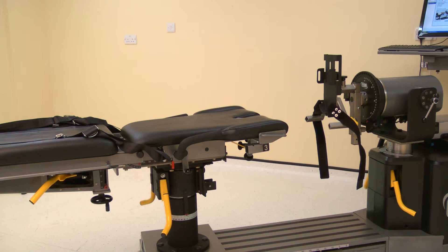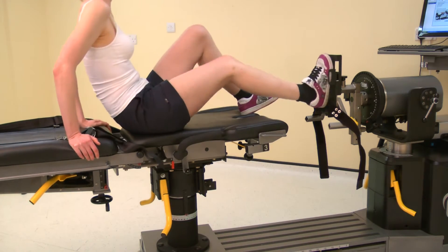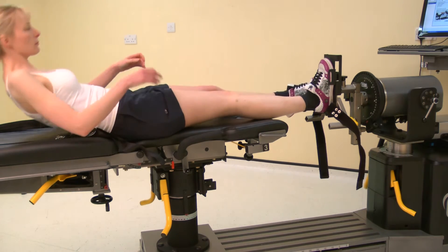Once the norm is positioned, ask the subject to lay on the chair. Ensure the subject's foot hits the footplate.